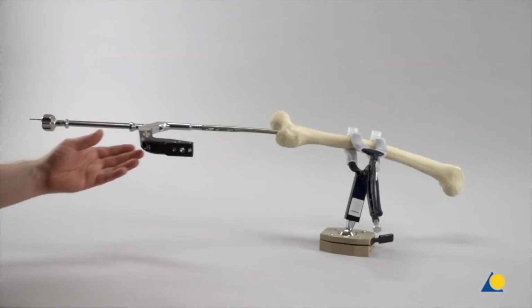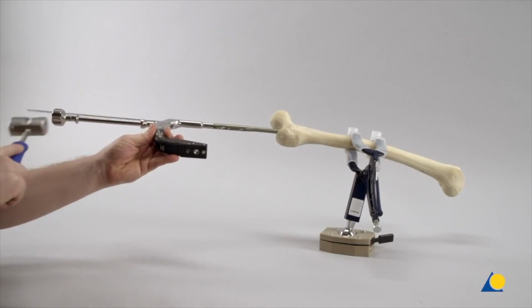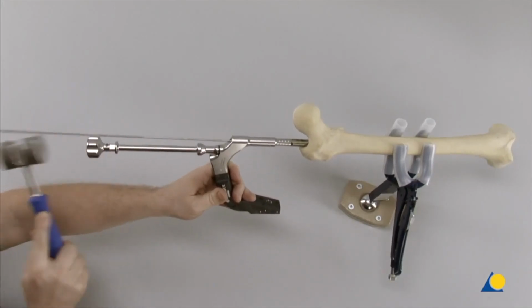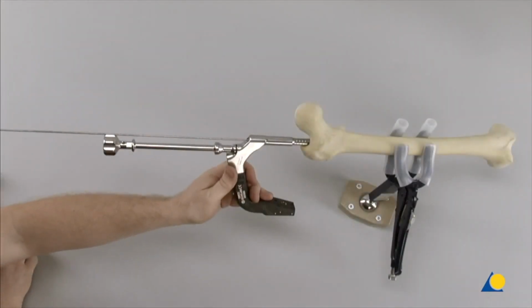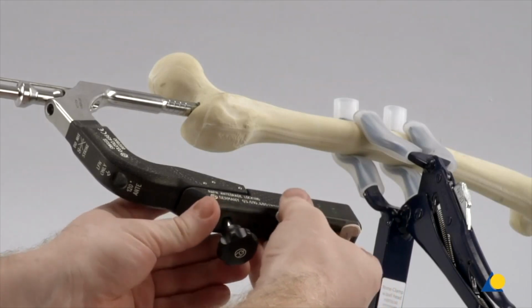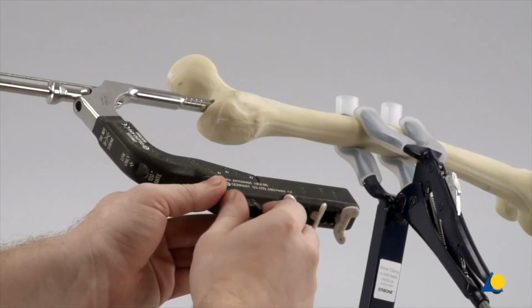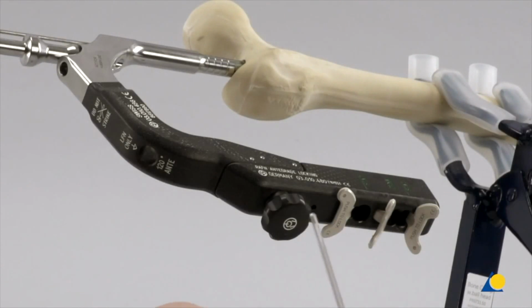The combined hammer is used to lightly hammer the nail until fully seated. The nail is inserted until the proximal end is at or just below the greater trochanter. The radiolucent aiming arm with cam locks is securely attached to the insertion handle by tightening the thumb screw. Note that the insertion depth of the nail should be at the level of the bone.